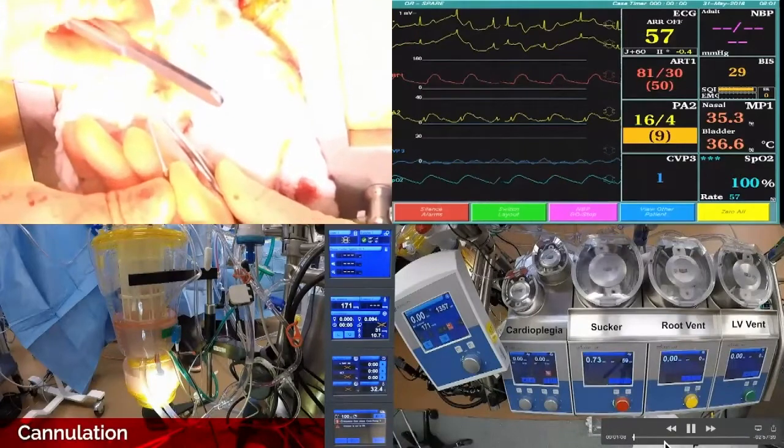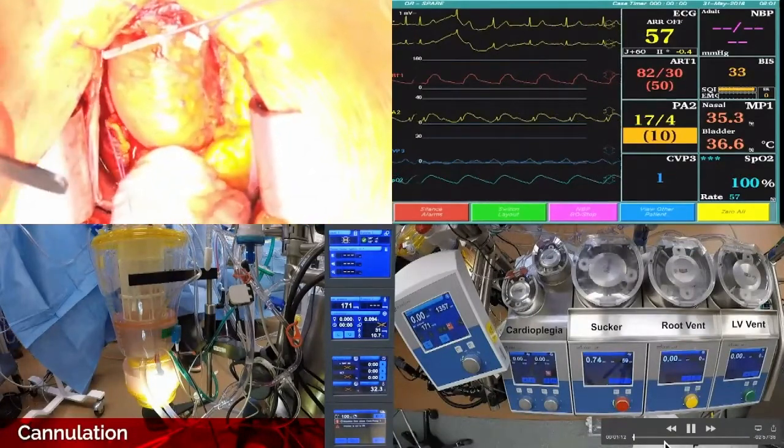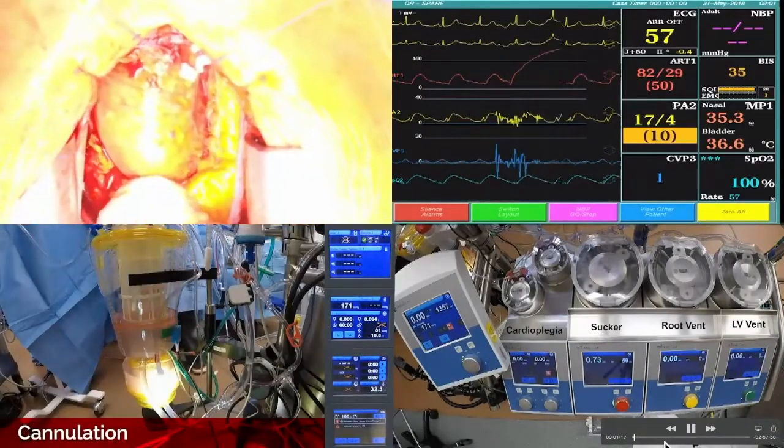That's a good point. How do you know that you've got the cannula into the correct lumen when you do this with an aneurysm like that? If it's just an aneurysm, it's fine. It's dissections that you have difficulty with. So aneurysms is not an issue. And again, I typically ask you what the pressures are too, on the aortic line. That's kind of basic. But dissections, yes, that is an issue.